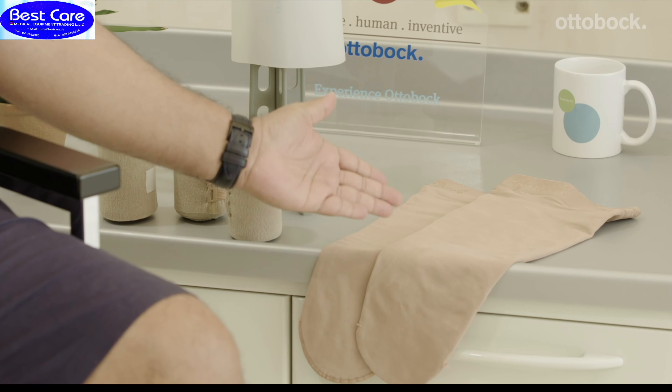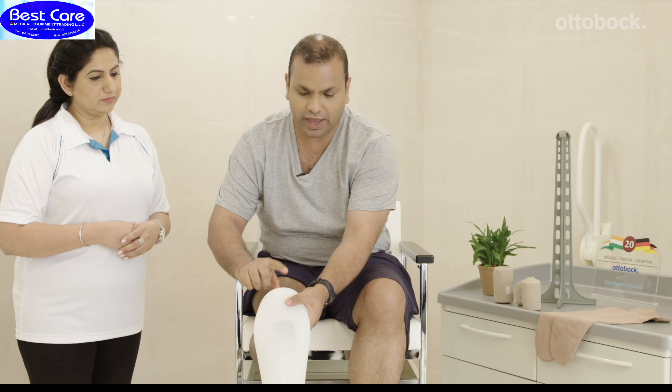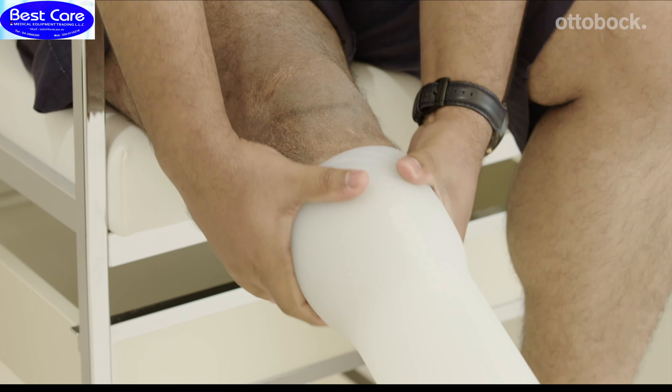I am Manali and I am a physiotherapist. I am Swapnit and I am an amputee. If you are a recent amputee, compression therapy is really important. You could use compression socks, compression bandages, or a compression liner. Today, I will demonstrate how to apply compression therapy using a compression liner. While using a compression liner, you make sure no air is trapped between the liner and the skin of your residual limb. You want the liner to be as close and completely in contact with the skin of your residual limb.